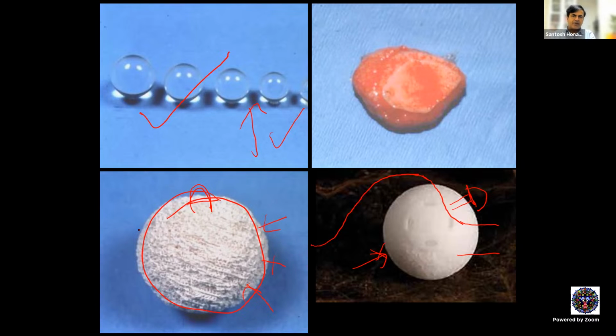The problem with wrapping is that once you wrap it, how will the blood vessels reach the implant? They cannot. So when you wrap it, you create small windows within the sclera to suture your extraocular muscles, four such windows. And on top of that, you cannot completely wrap it. You leave the posterior aspect of the implant unwrapped so that there is egress for vascularization and fibrous tissue from the posterior aspect of the implant. If you leave the anterior surface of the implant unwrapped, then this rough surface will rub against the prosthesis, and ultimately there's a higher chance of extrusion. So the anterior surface should be covered with sclera.